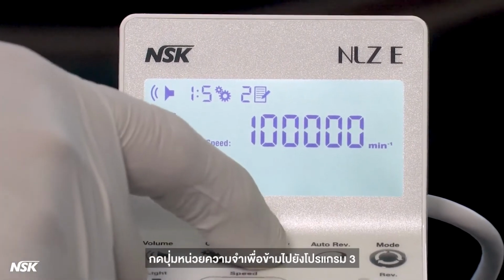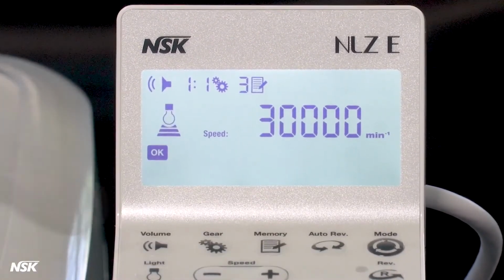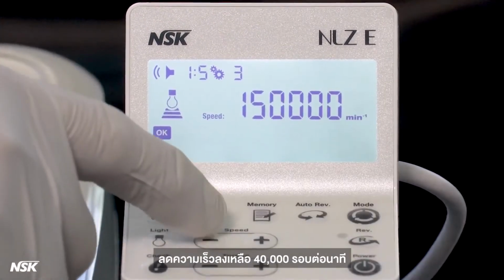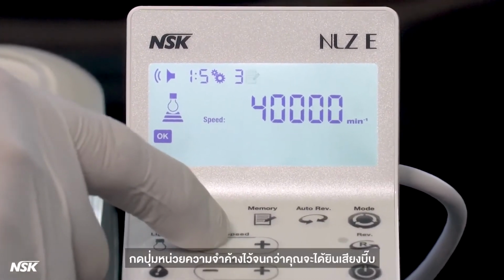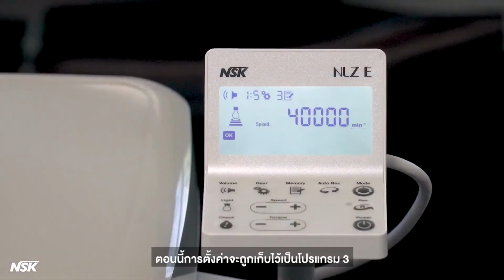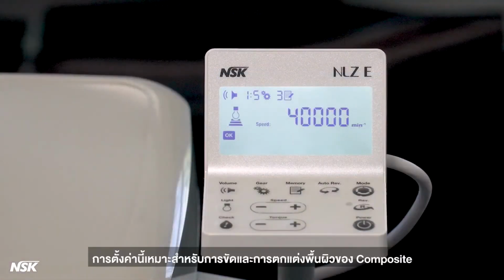Press the memory button to jump to program number 3. Set the gear ratio to 1 to 5. Dial down the speed to 40,000 RPM. Press and hold the memory button until you hear a beep. Now the setting is stored as program number 3. This setting is suitable for polishing and finishing the surface of composite.